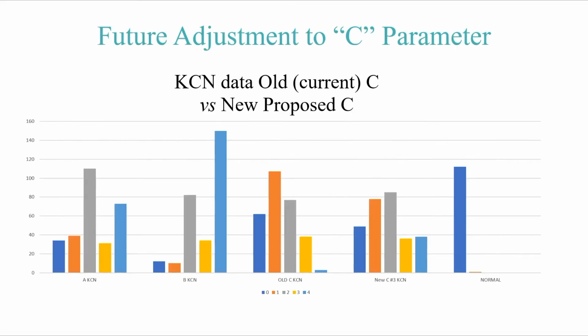In addition, I'm just going to throw out, we actually will be making a slight adjustment to the C parameter on the next software update. The actual C parameter is going to be updated somewhat based on some work we did in larger databases.